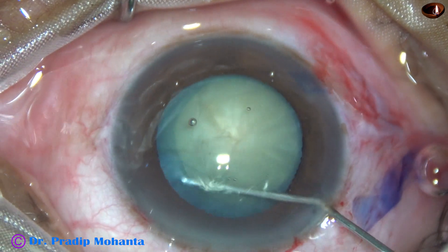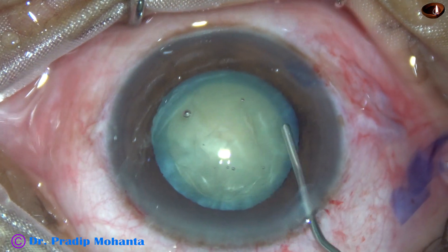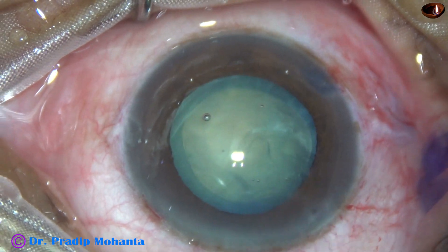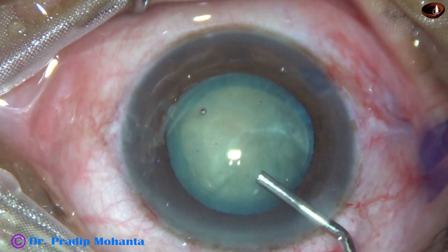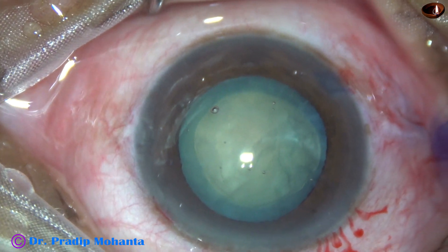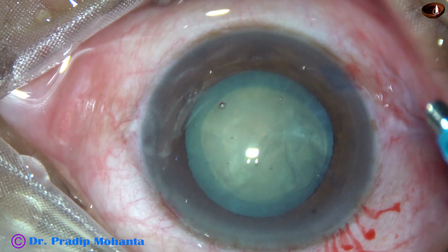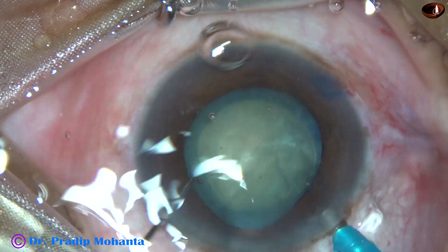Now hydrodissection is done — a little bit of hydrodissection. In white cataract, we can see only the forward movement of the lens mass; we cannot see the fluid wave. We must not inject a lot of fluid, as there can be blowout rupture of the posterior capsule. So only small amounts of BSS is injected. These cases can be done without hydro also.